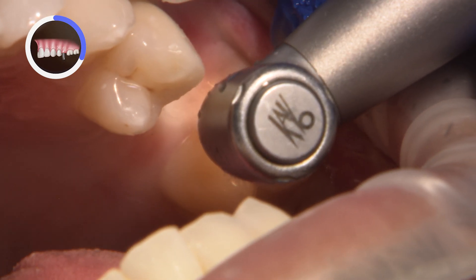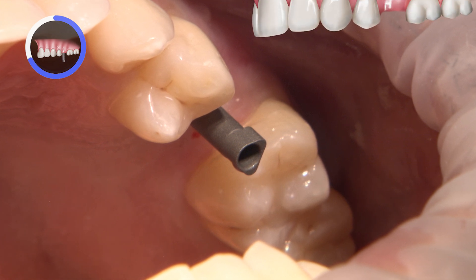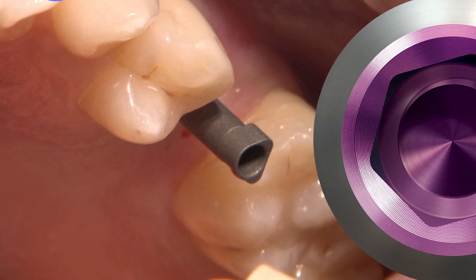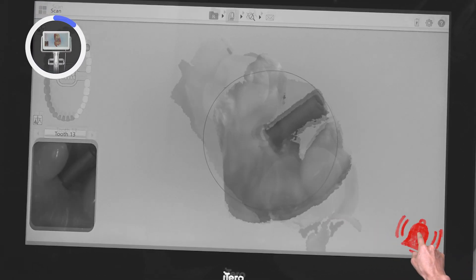Inform your patient ahead of time. It is important not to abrade the scan body itself, so if it is in the way, take it out before your adjustments are made. I re-seat the scan body and use the iTero Element to acquire a preliminary scan of the implant site and the adjacent teeth. I find it easier sometimes to assess the path of insertion on the screen than looking in the mouth.